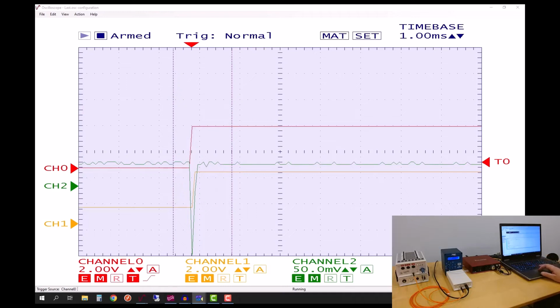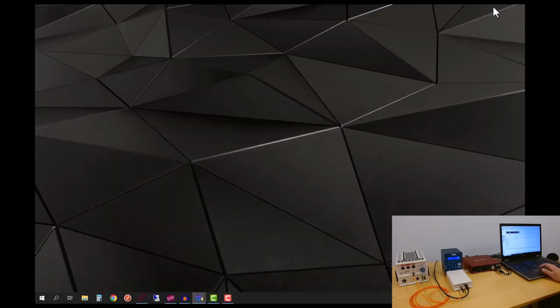But what you see here is probably typical of most sound devices that are not specifically recommended for presentation. You might be able to get a little bit better delay and jitter specs than that for the optimized sound cards, but this is pretty typical. So you can see that there's a big advantage in triggering directly on the audio from the sound device, and that's what this red code is. So let's just look at what those codes look like in the EEG software when we're actually recording.